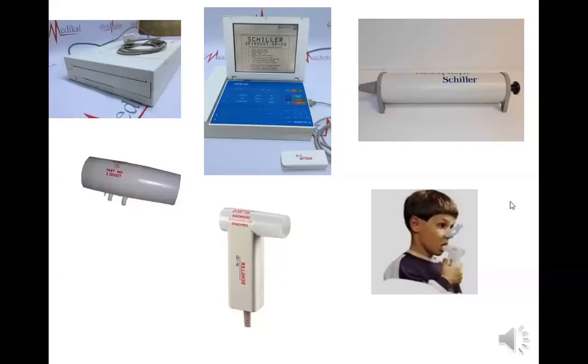So this is the spirometer, and unfortunately, we're not going to get to look at it tonight, but this is the mouthpiece. And it's really important that you have a good lip seal and the nose is pinched, so no air escapes, right? If you go to the doctor, sometimes they don't even put your nose, the nurse. So it's really important that no air escapes to get a normal reading and a valuable reading. This is just a calibrator, which I'll show you what happens with that.